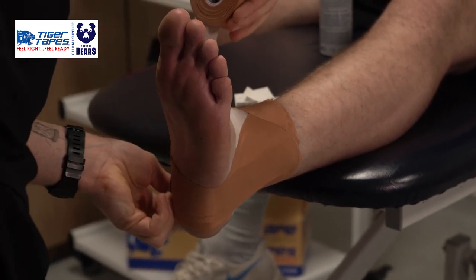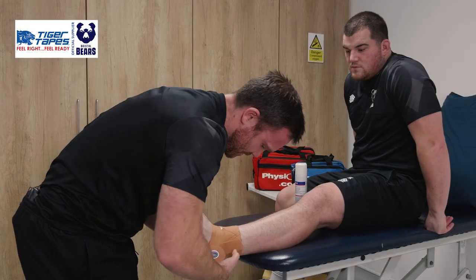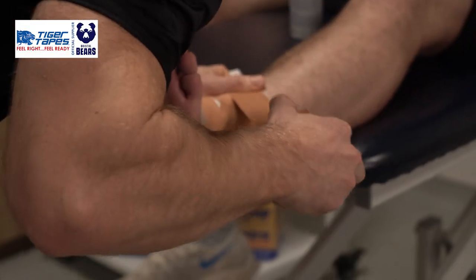Starting from the medial side of the calcaneus, coming across there and then attaching onto that lateral aspect. With that base there, we've got our stirrups. To add a belt and braces, we can also do a heel lock.